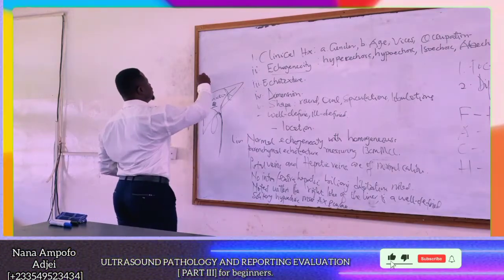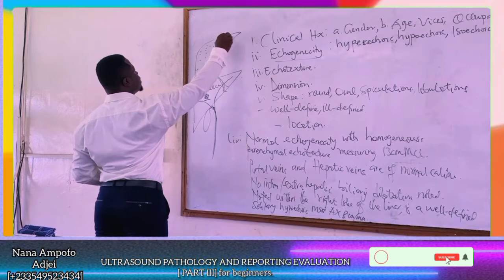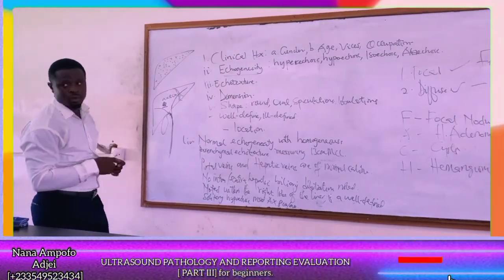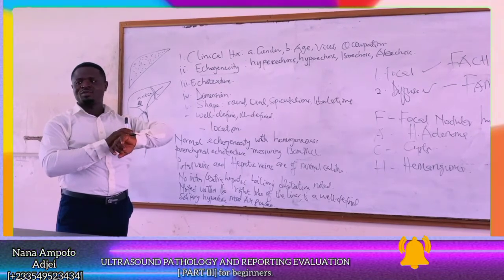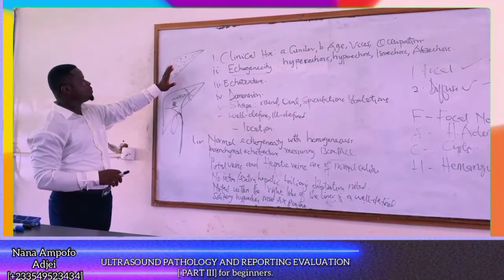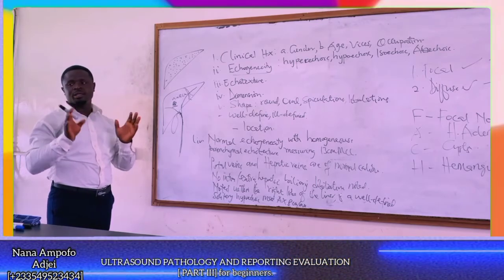Assuming this is a portal vein, hyperechoic, and the parenchyma of the liver becomes hypoechoic. Increased visualization of the portal vein walls with decreased echogenicity of the liver parenchyma. So hypoechoic liver, hyperechoic portal veins diffusely.